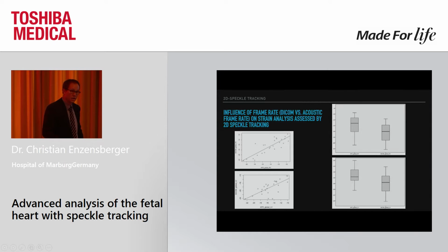Again, this analysis is still in progress because we have about 300 patients already measured, and I'm expecting nothing other than what we already have as information, but as I said, it's still an ongoing analysis.